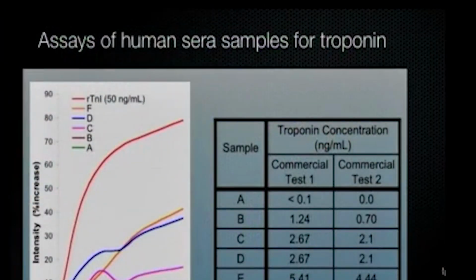So it's actually not just protein that we can look for. These are some data on troponin. This is still a protein antibody assay. The clinically relevant level is around here, above this line, above 2. And you can see this is the signal. This is indicative of the noise of the system.